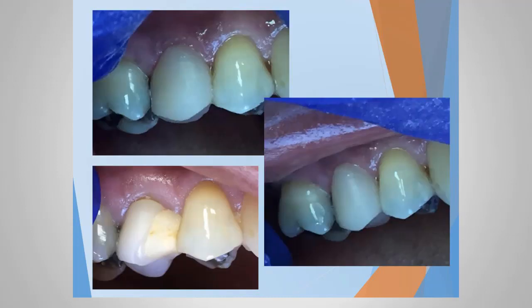We started with this tooth needing a new crown, and this is the temporary that we made off of that. That's why it's really important that when you're starting and taking this impression of this tooth for your matrix, you want to get a good shape of the tooth that you're going to be making the temporary for.